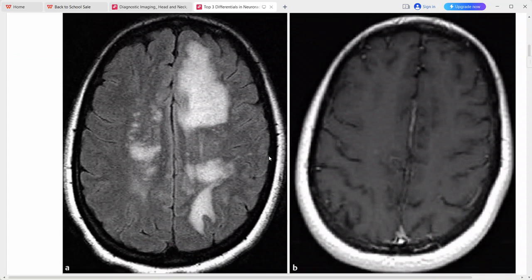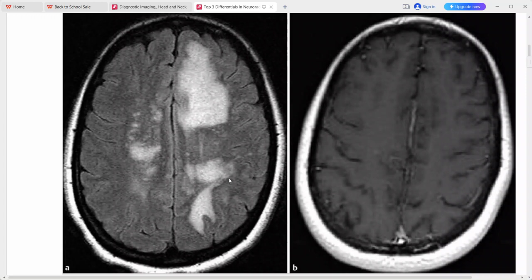This is the next case. These are the MRI images of a 45-year-old woman who presented with seizures. This is the FLAIR sequence and this is the post-gadolinium T1 sequence. There are extensive bilateral FLAIR hyperintensities without significant mass effect, and on the post-contrast there is no significant enhancement in these lesions.